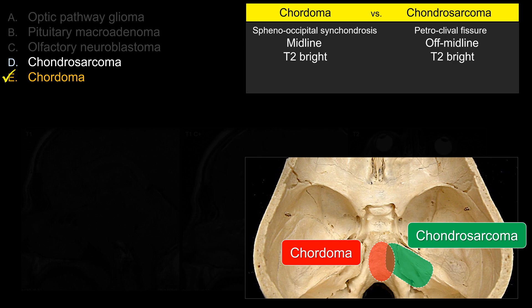Both chordoma and chondrosarcoma are relatively T2-bright, so that does not help you distinguish between them — but it may help distinguish these two entities from other lesions. It is said that chordoma tends to have lower ADC compared to chondrosarcoma, but in reality, unless you can compare them side by side, it's sometimes difficult to use that information to make the differentiation.